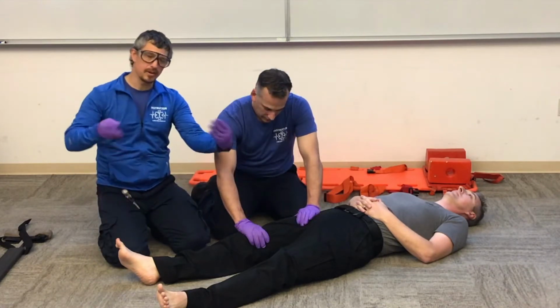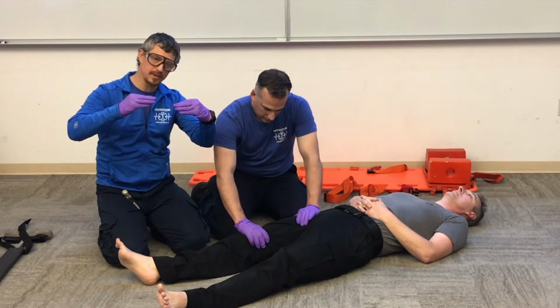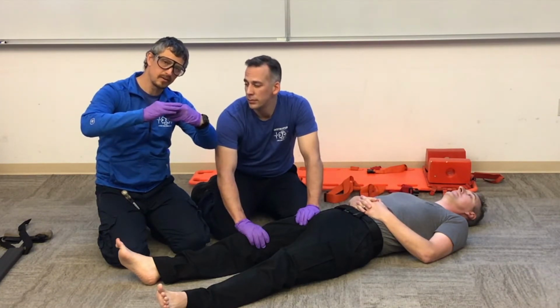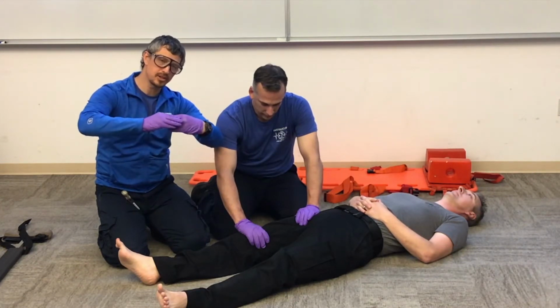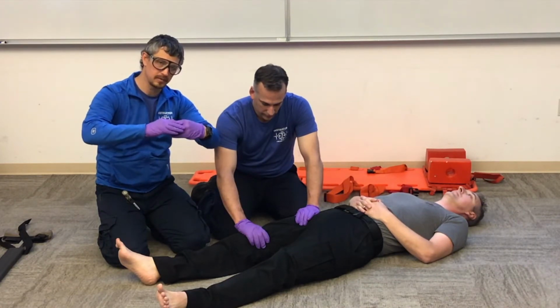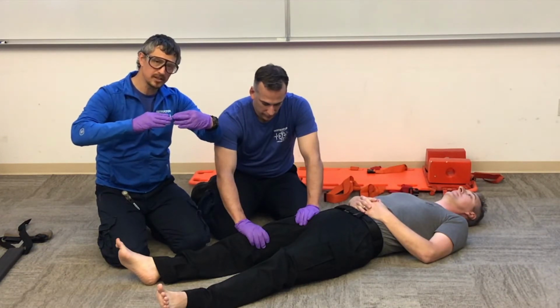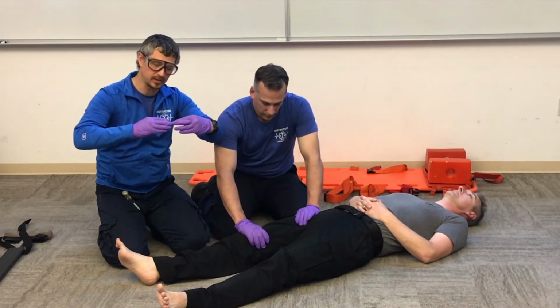When we have a femur that breaks, we have a top piece and a bottom piece, and that major muscle pulls them together and overlaps. What we want to do is make sure that we don't have any unnecessary movement to those two injured pieces. So if we have to move them for a device where we have to pull the leg, we're going to pull that manual traction and hold it until we have a device to continue holding that traction.